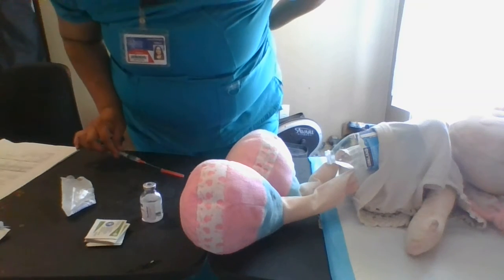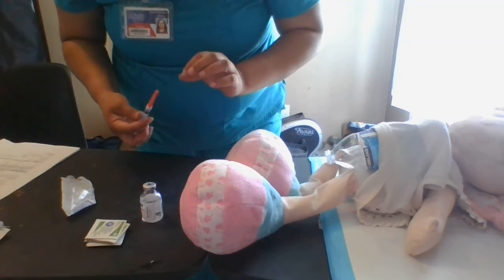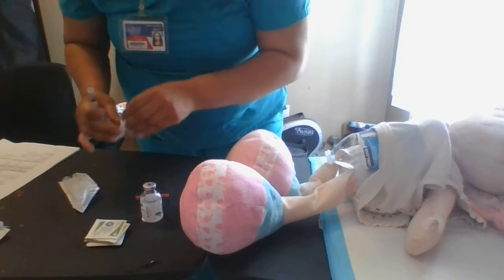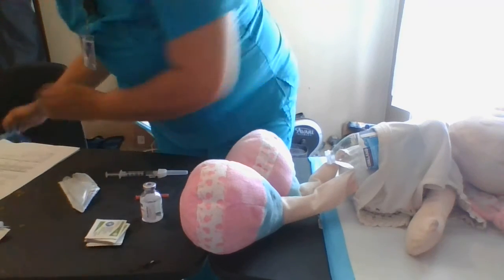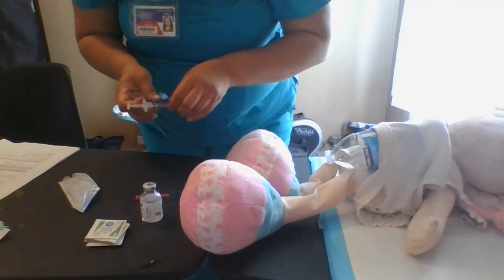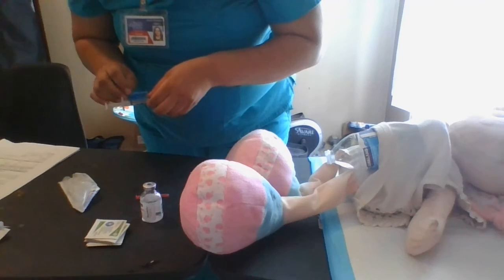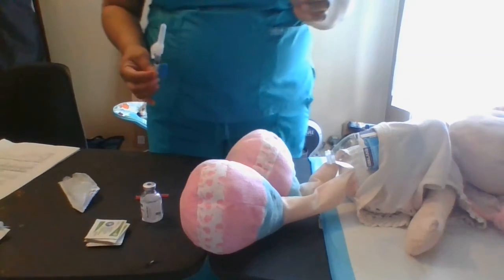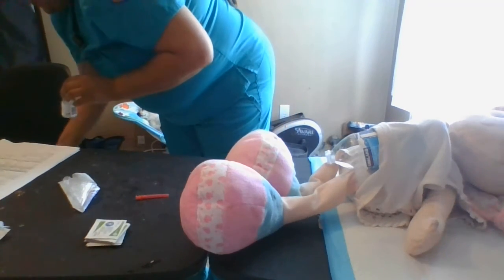I will scoop. Now I will attach my needle that I will be administering with. I have my label here for heparin 1 mil per 5,000 units, my name, date, and time. Okay. I am now ready to enter my patient's room.